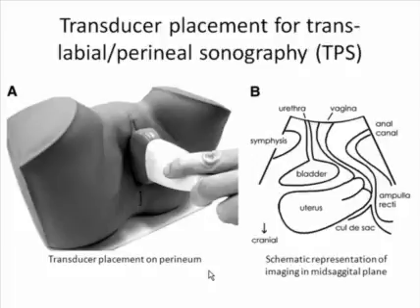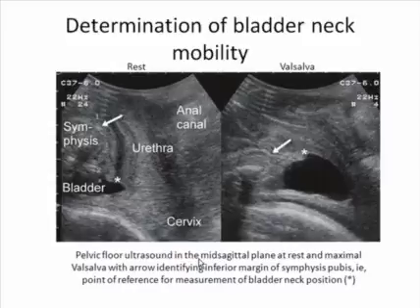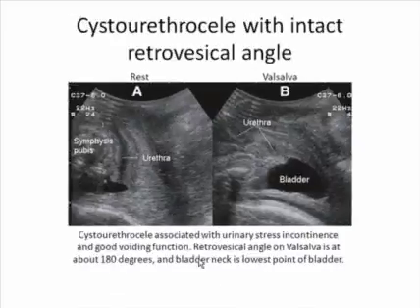Remember, as shown in this diagram from Dr. Dietz, that we can press on the perineal area. It doesn't produce any discomfort in the patient or, in fact, in a plastic model like this. Okay, so here are some pictures where we're imaging at rest and Valsalva. We can see initially the urethra very nicely. At Valsalva, there clearly is a small cystocele.